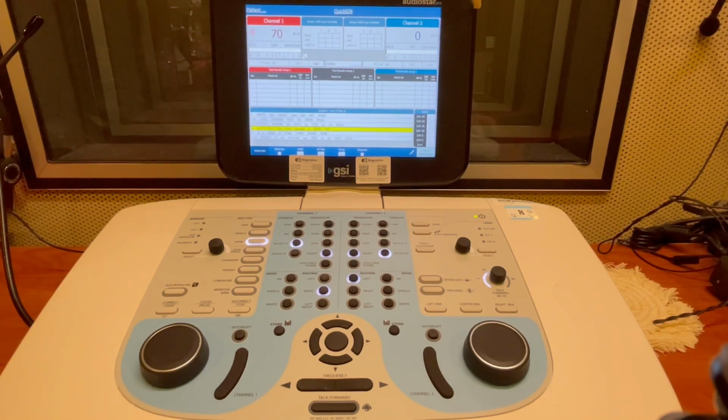What's nice is as you go through this, it'll score it for you. And once we hit score, we'll be able to see that value here. When we have 2 tests, we'll be able to see that average up here. It'll probably put just the 1 up there, but it'll average it together for us as well.